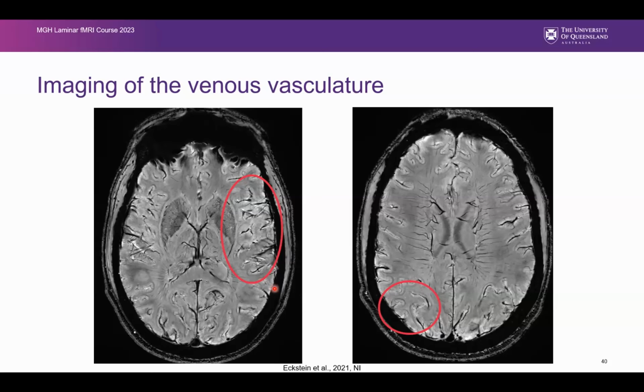If you acquired a venous vasculature image, then segment where the veins are, and look whether this is next to your activity, this is not easy, because it starts to be blurry. A vein should be a really well defined, round object, but here you get all these smudges, and this white stuff.